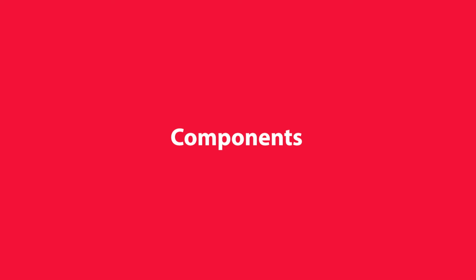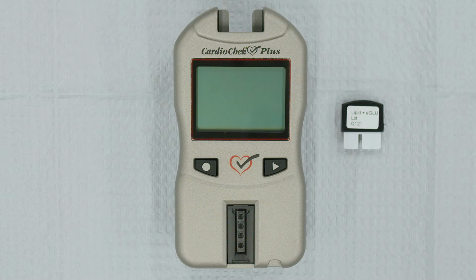Let's go over the components of your CardioChek Plus analyzer. The display shows test results, messages, the time, the date, and stored results. The Enter button allows you to turn the analyzer on and accept menu choices. The Next button also allows you to turn the analyzer on and advance to the next menu option. The Memo Chip port is where you'll insert the memo chip that comes with your PTS Panel's test strips.